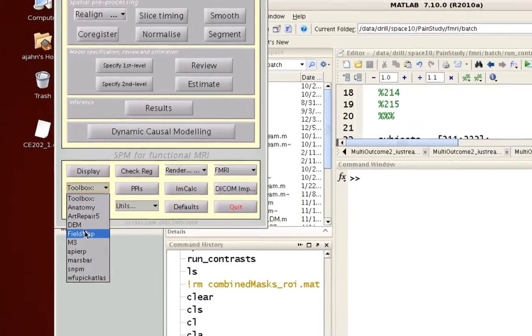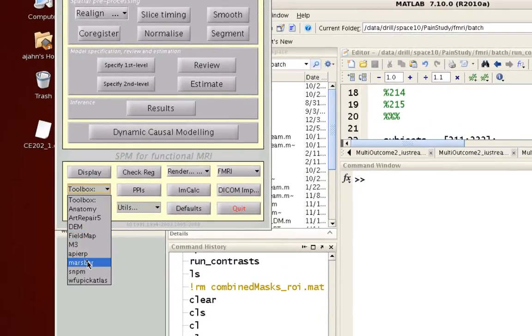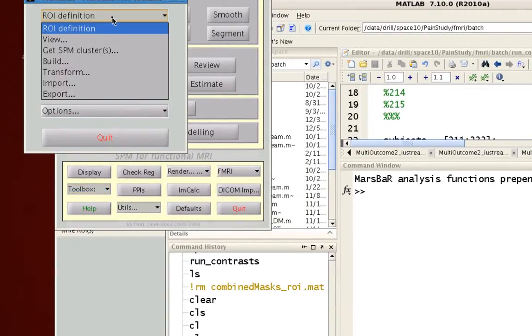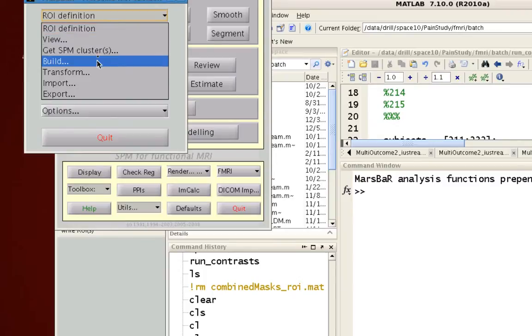So open up toolboxes and then MarsBar. When you get to ROI definition here, I've already created three separate ROIs which are roughly in the medial prefrontal cortex area.